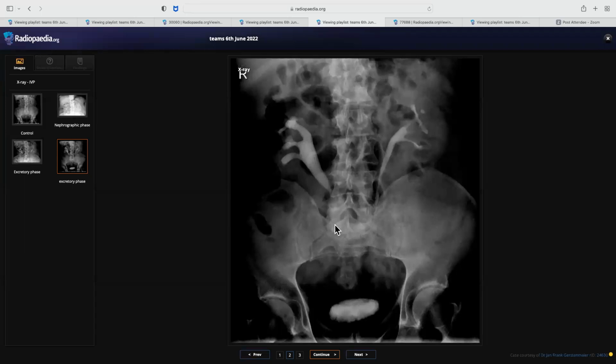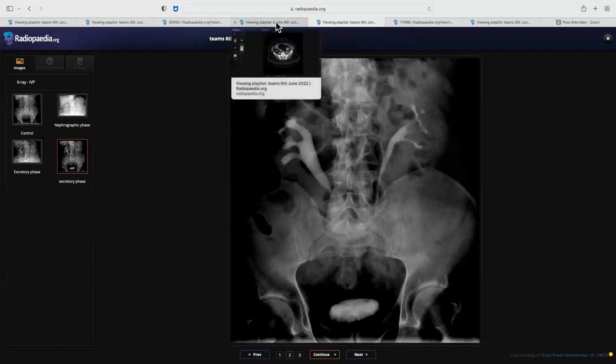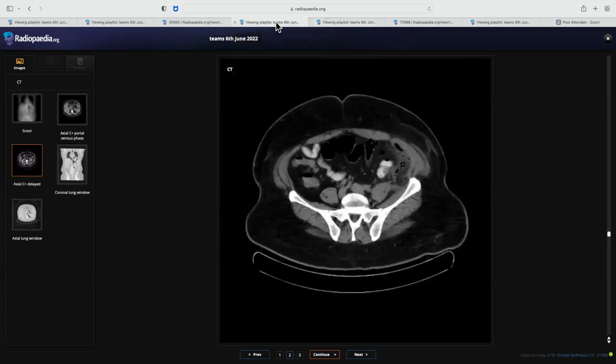Here you don't have a CT, so you are thinking it is retroperitoneal fibrosis. Even if you have a CT, still you should say one differential as lymphoma. Because if lymphoma is there, it would be cranial to L4-5 most commonly, and non-lymphomatous retroperitoneal fibrosis is mainly centered at L4-5. And then Erdheim-Chester, that you might not say, it's fine, but lymphoma with RPF as one differential, if you say, it's always good. Sometimes it does happen that it is not the characteristic one, but it is always better to tell one differential at least.